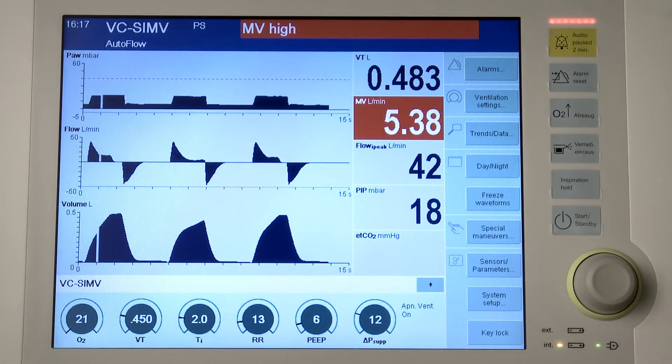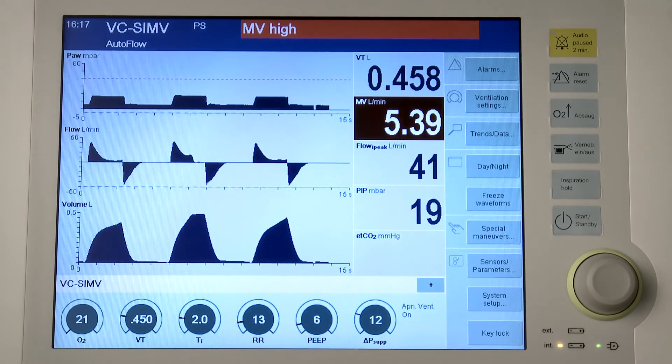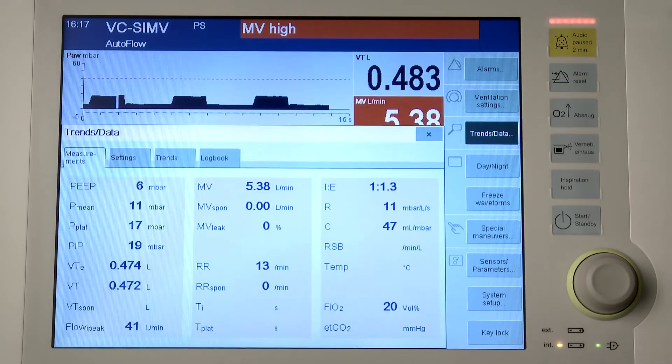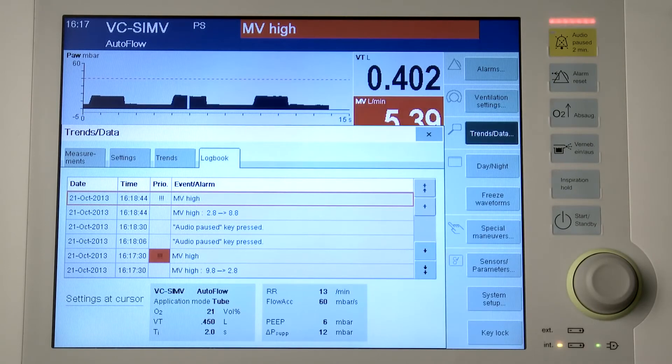High priority alarm messages that are no longer active are displayed in the background color of the alarm message field. The parameter box of the parameter triggering the alarm flashes in the color of the alarm priority. Red means warning and is an alarm with high priority. Yellow means caution and is an alarm with medium priority. Cyan means note and is an alarm with low priority. On the logbook page, the priority of the alarm messages is also indicated by exclamation marks.